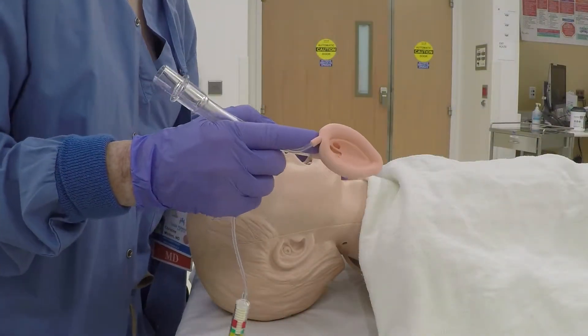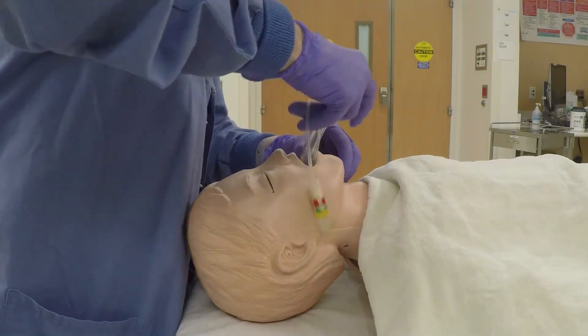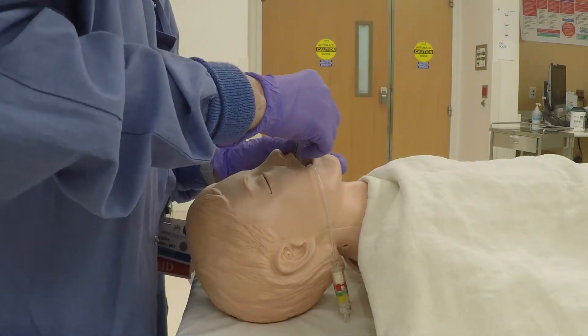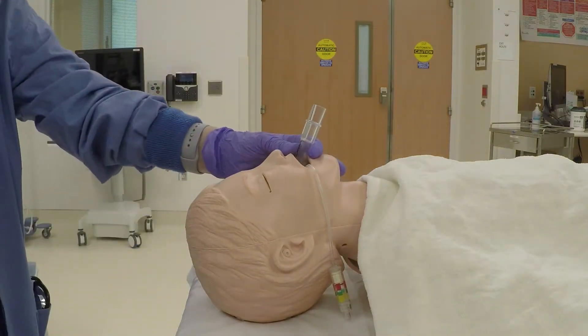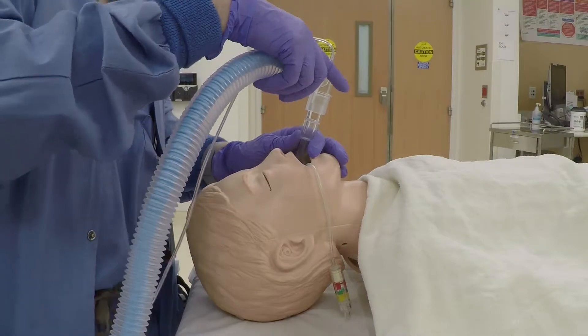Let's look at this insertion again from the side. After the LMA seats into the posterior pharynx, connect your ventilation apparatus and test to ensure that you can ventilate.